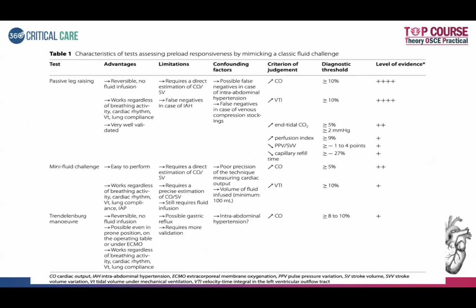Then coming on to the mini fluid challenge test. In passive leg raising, if you don't have a real-time cardiac output monitor, the other alternative you can use is the VTI, that is the aortic VTI, which I'll explain next.